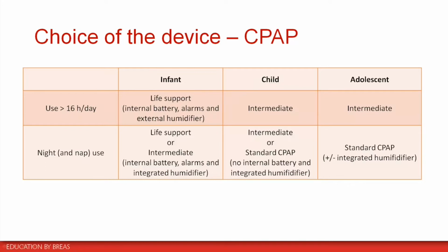And that means that there will be an external humidifier that sometimes is not very nice for the parents, but we don't have a choice, because we go for security. And once again, this is not because the infant needs a life support device, it's just because he's very small and needs ventilation for a long period of time.